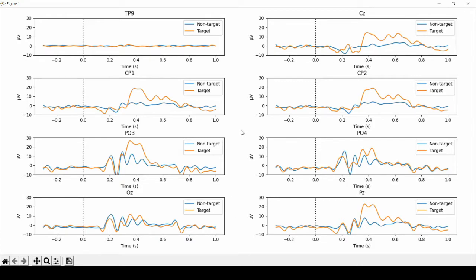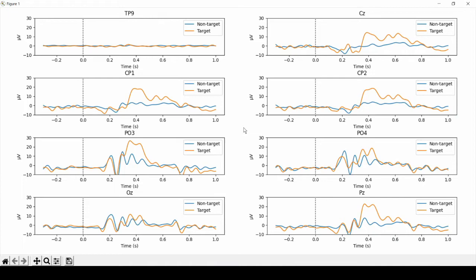There is one plot for each of the eight channels that we've recorded. What we expect to see here is an effect around parietal and central areas in the event-related potential. So a difference between the targets, the red oval stimuli, and the non-targets, the blue squares. By targets, we mean the infrequent stimuli that are different from the standard ones occurring more frequently, and that is the oddball. For the targets, we have the orange graphs. For the non-targets, we have the blue ones.